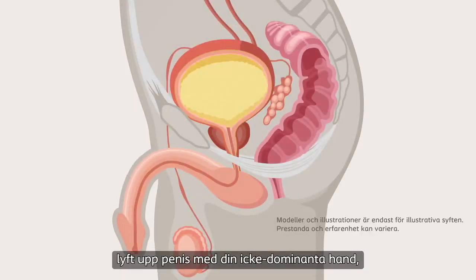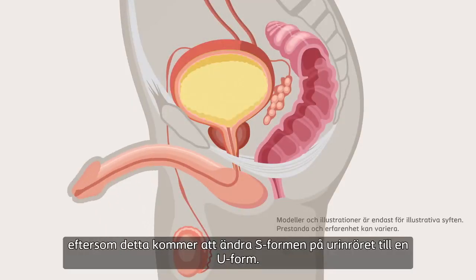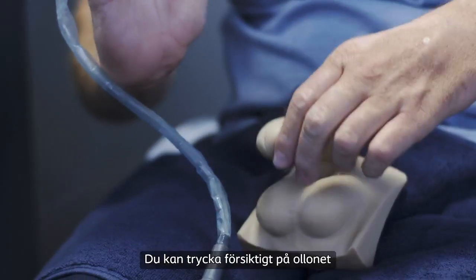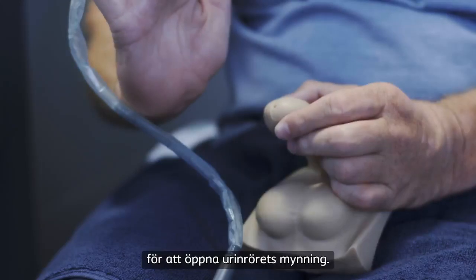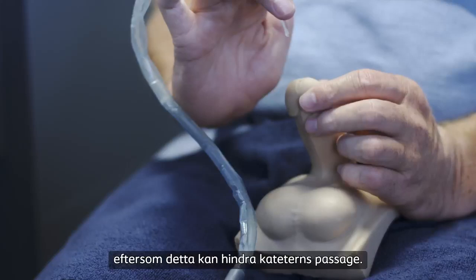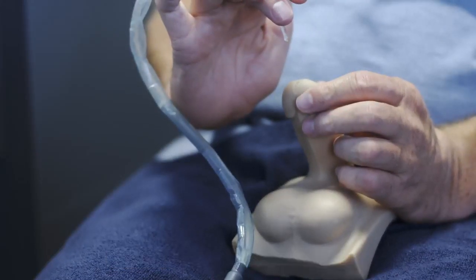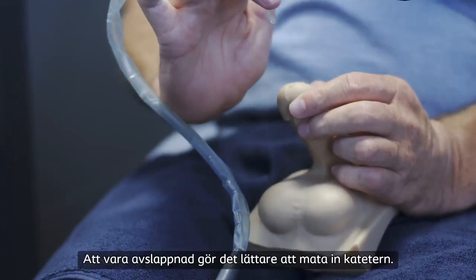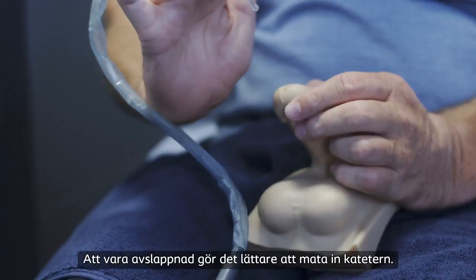To make insertion easier, lift your penis with your non-dominant hand as this will change the S shape of the urethra into a U shape. You can apply gentle pressure to the head of your penis to open the entrance of the urethra, but be careful not to squeeze your penis as this may obstruct the passage of the catheter. If you're a bit nervous, try taking a couple of deep breaths. Being relaxed will make inserting the catheter easier.